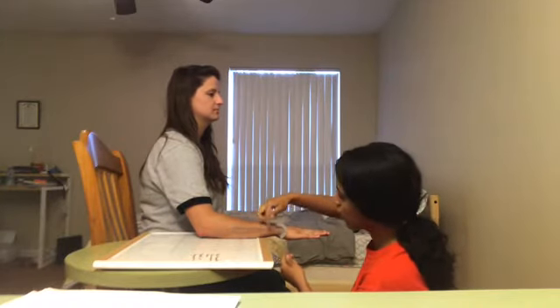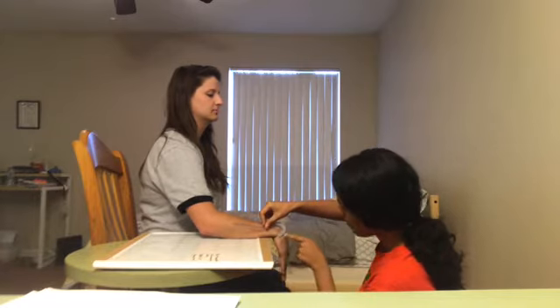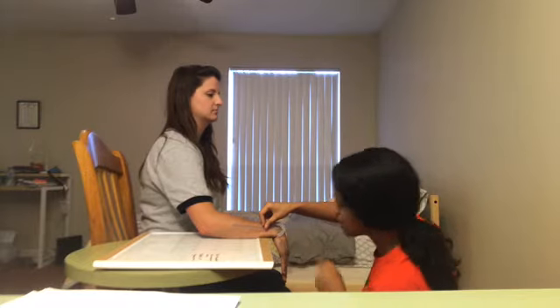We're going to perform wrist flexion. We're going to put the axis over the triquetrum. The stationary arm is going to be over the midline of the ulna. Can you perform wrist flexion? And then we're going to measure to the 5th metacarpal, and it's about 60 degrees.